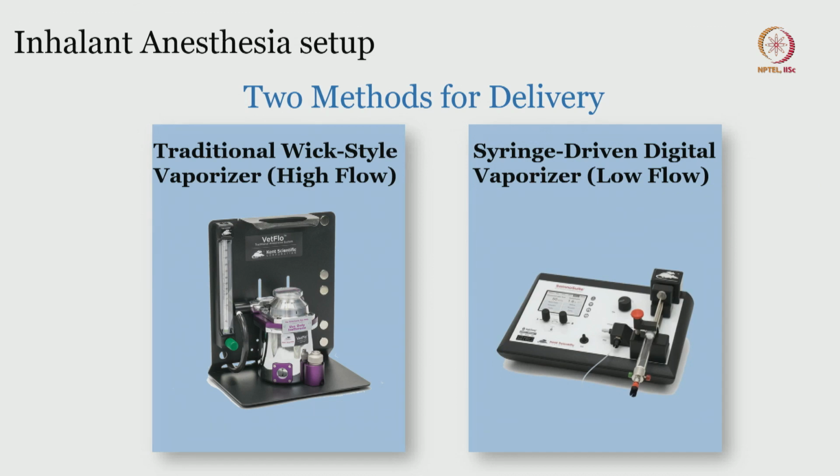When it comes to the inhalant anesthesia setup, which is the workhorse of the entire general anesthesia workflow, you have two types of delivery. One is high flow delivery, another one is low flow delivery. We will come to the details of it.